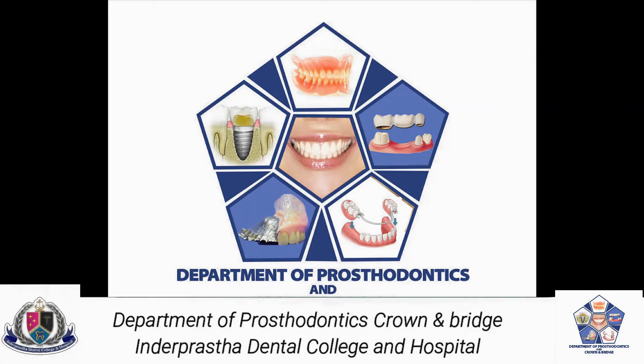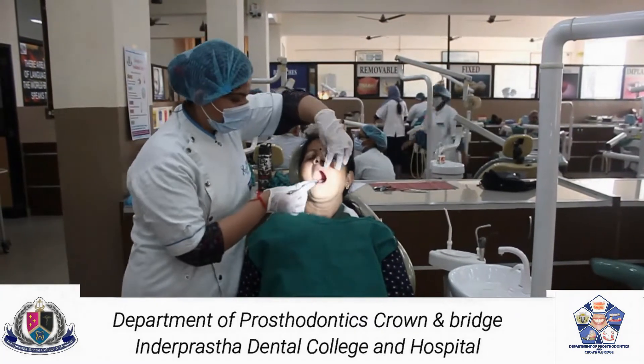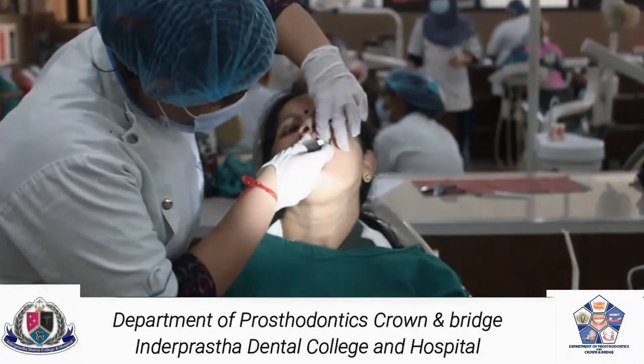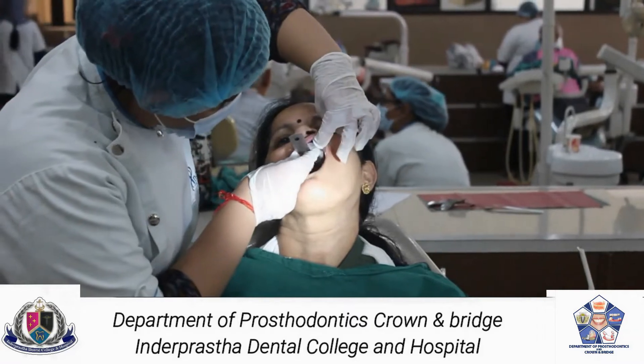In this video we will demonstrate the technique to make a primary impression using impression compound. Take an edentulous non-perforated tray, place it inside the patient's mouth, check it posteriorly followed by checking the extensions of the tray.